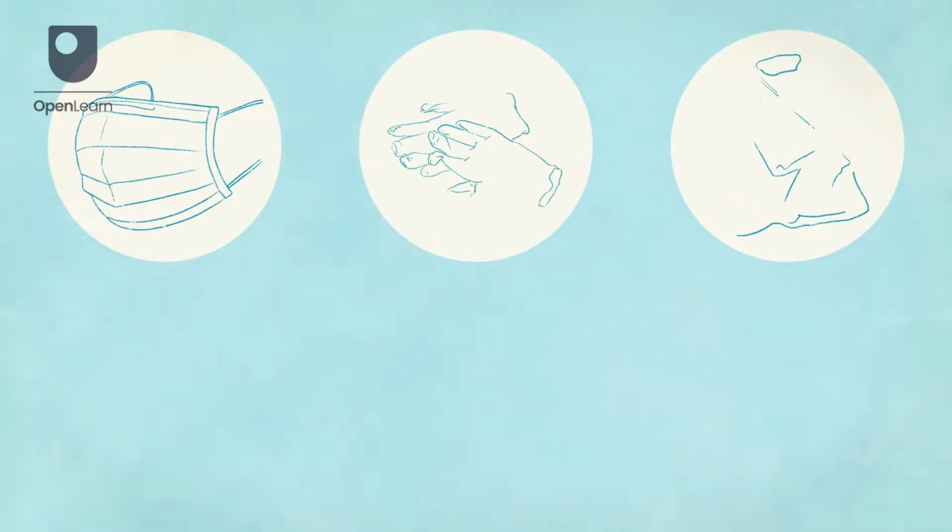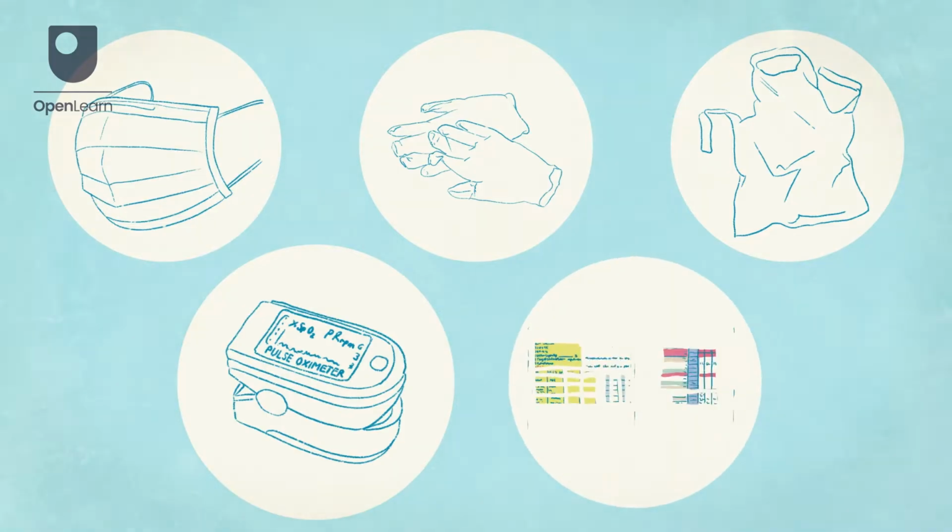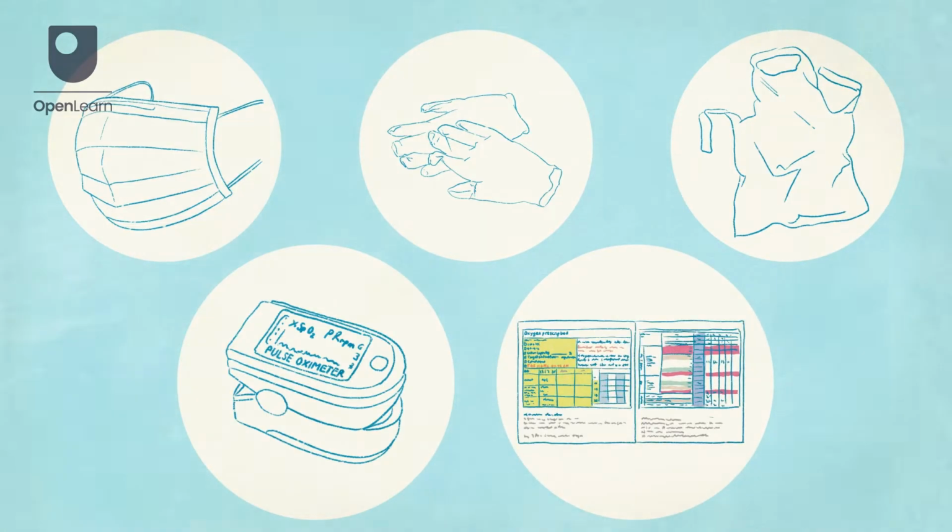Before starting the procedure, you must gather all the equipment you need, assess the needs of the person, and check the prescription chart for the correct parameters.